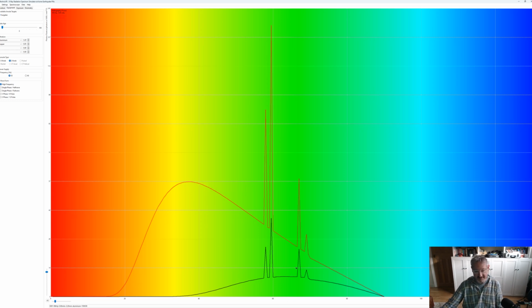So we've massively increased the one measure of the average energy of the beam. So this beam is going to be much more penetrating than this beam. Having said that, there's a lot less photons in this beam because a lot of them have been attenuated, so you'd have to increase your mAs to get the more penetrating beam than this beam.